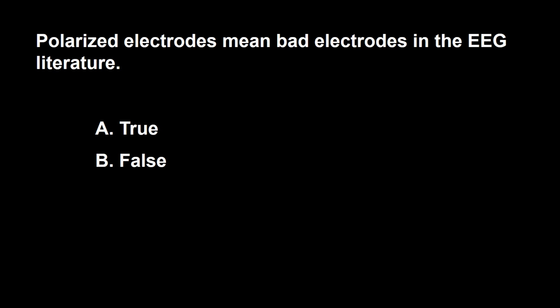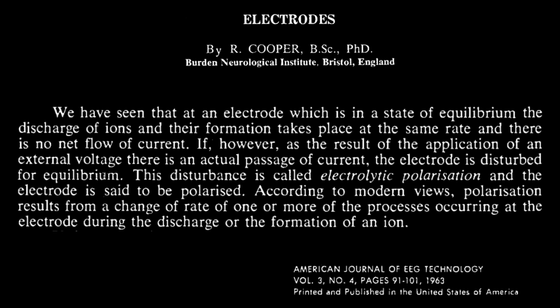The next question is, polarized electrodes means bad electrodes in the EEG literature. A. True. B. False. I'd like you to read this paragraph again carefully.